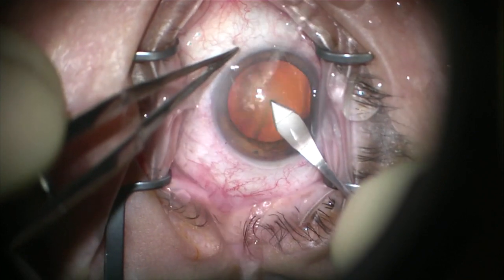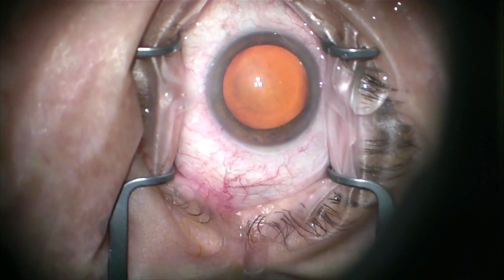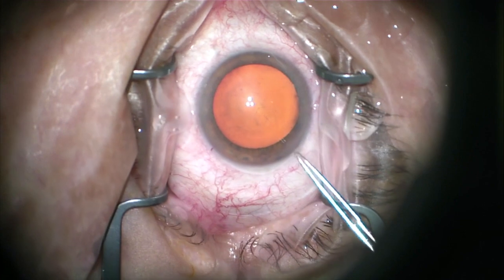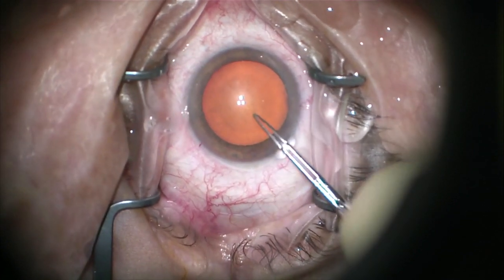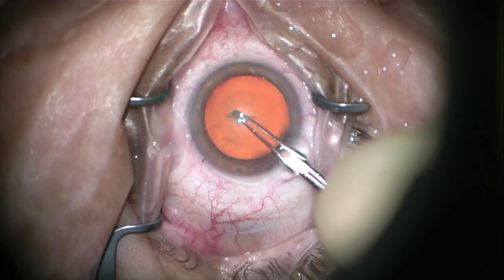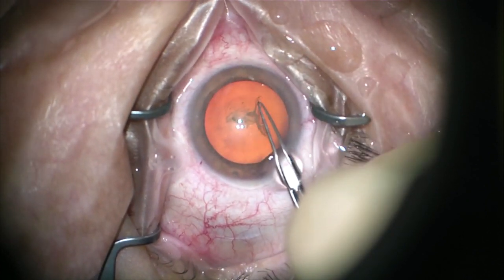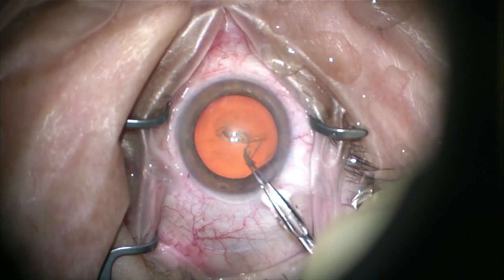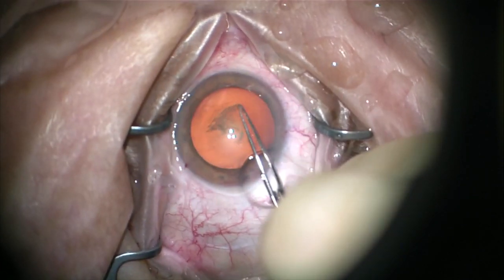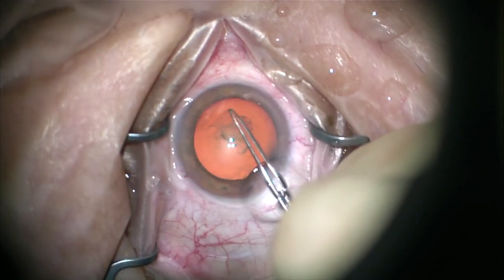Here I'm using a 2.4 keratome and I actually use it to go in and pierce the anterior capsule to get my capsulorrhexis started. My partner Dr. Shelby taught me that. I think it's fine when you're using a 2.4 keratome, but if you use a 2.75 with a knife on the edges I would avoid it. You may have noticed I go in with the Utrata's closed together, lift up, and start my capsulorrhexis going the direction that I want it to. After that it's not rocket science — just pull it where you want it to go.